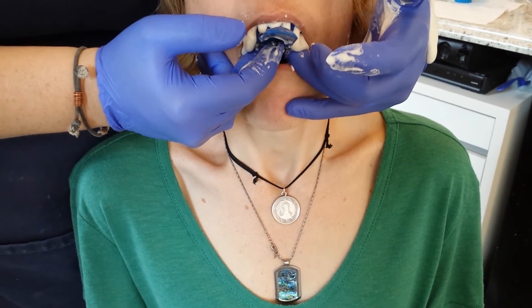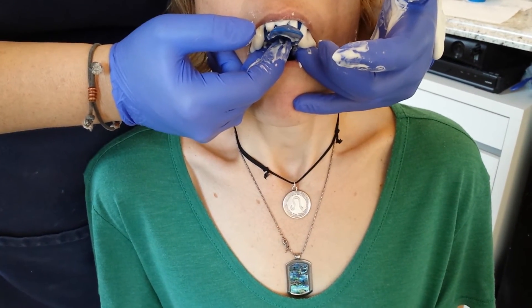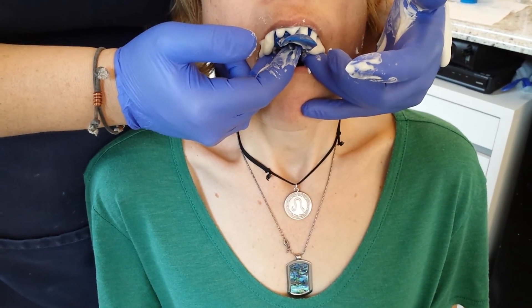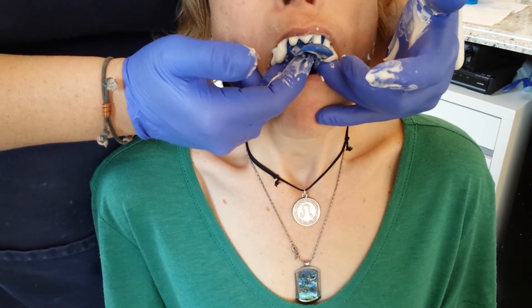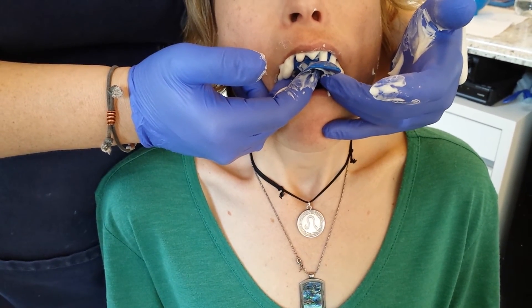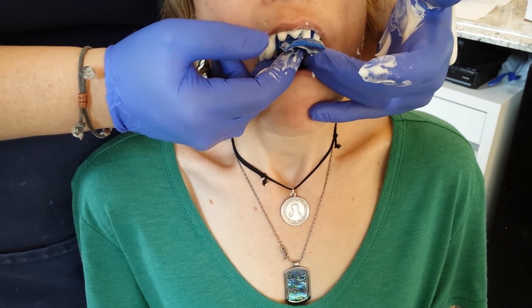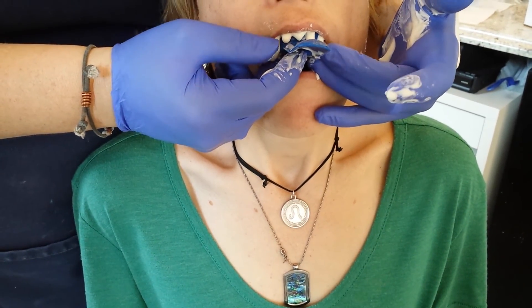Always hold the tray in the patient's mouth — never put it in and walk away. I know that sounds elementary, but I've seen it happen. Hold it in at the same pressure. Never press harder or lighter; keep a normal, consistent pressure at all times so you're not seating it more and more as it sets up. Just allow it to set where you originally placed it.